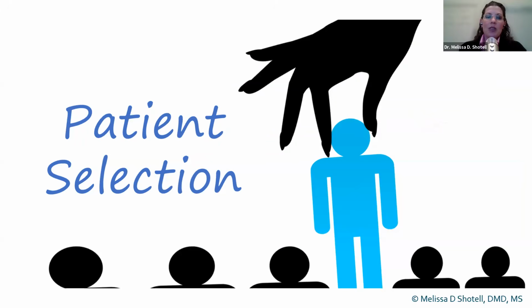But what's really critical is your patient selection. When you first begin in-office clear aligners, you want to set yourself up for success by finding cases that you'll be able to create the treatment setup for and design the aligners and have a highly accurate result with, by choosing cases that are maybe more appropriate for a first in-office aligner case versus a very complex case, maybe a 4x extraction case.